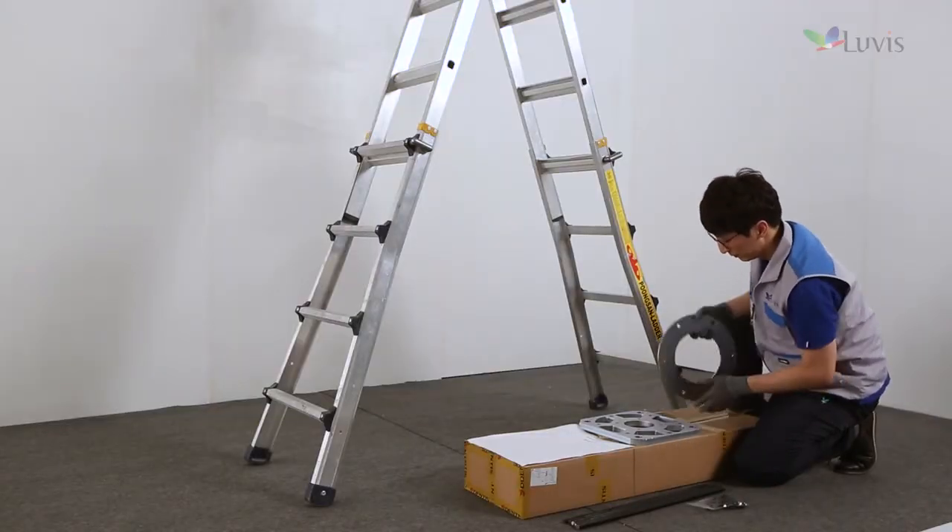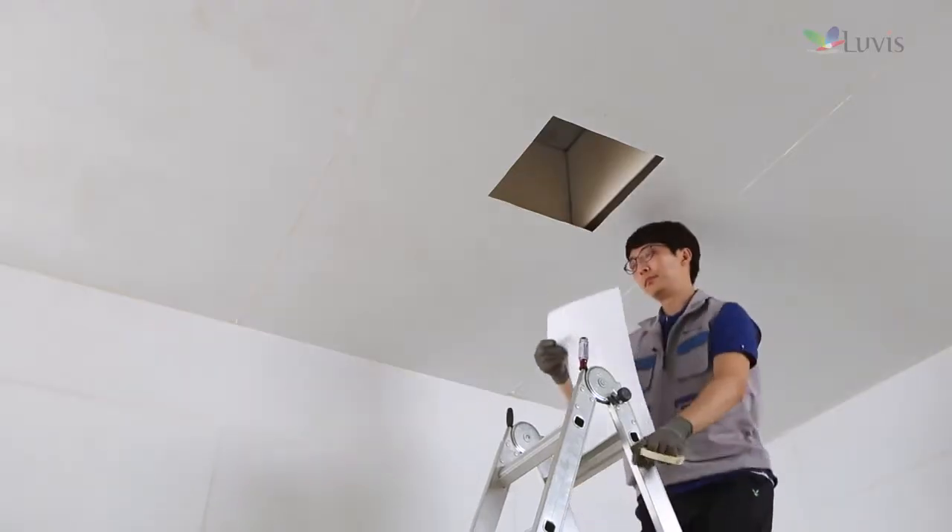Prepare the guide bracket and check its status. Select a spot on the ceiling where the product will be installed, and attach the shape paper sheet of the guide bracket.